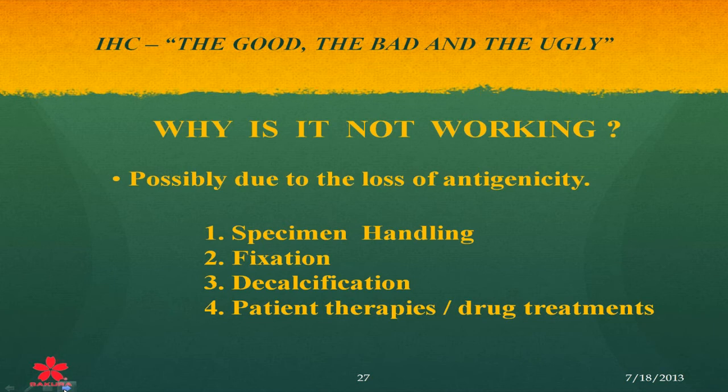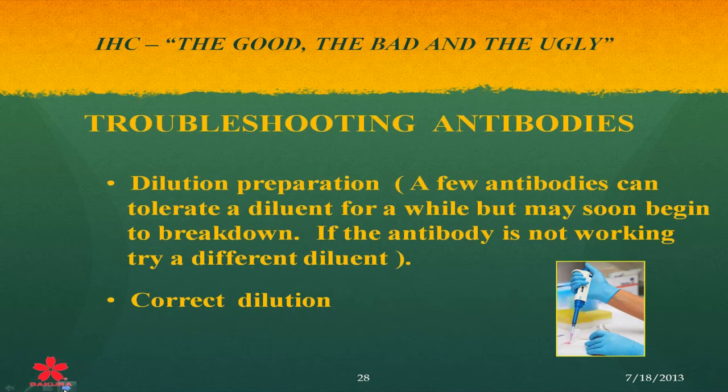And I know all of us have asked ourselves this question: why is it not working? Possibly due to the loss of antigenicity, specimen handling, fixation, decalcification. But sometimes there is something a lot of us don't think about, which is the patient therapies or drug treatments that they're on. This can cause a problem too. So just check all these and you'll come up with a solution on why it's not working.